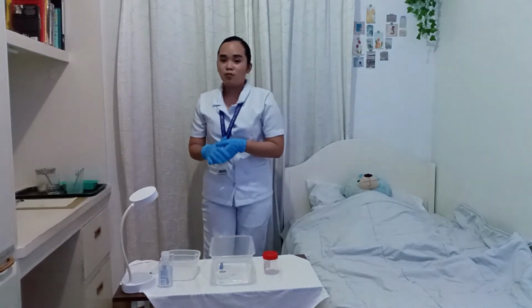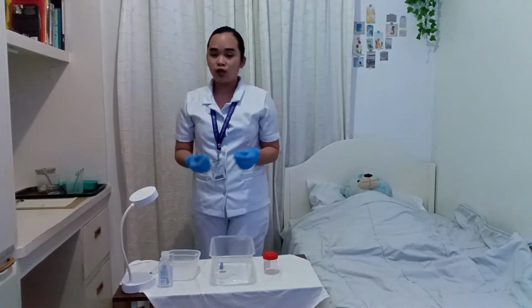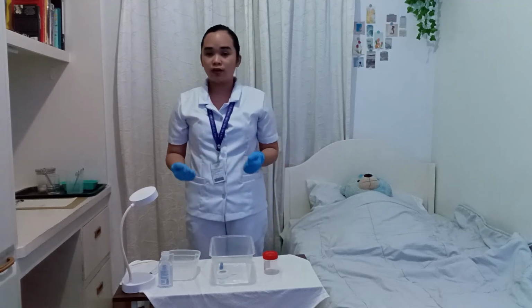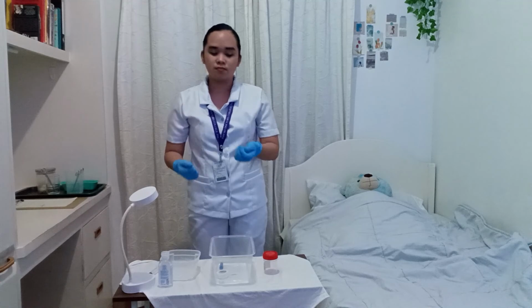Okay. So, now I'm going to perform the aftercare of the equipment and I'm going to perform thorough hand washing to deter the spread of pathogenic microorganisms.